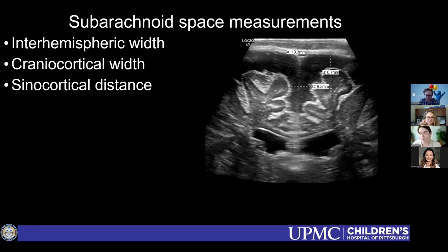Yeah, that's definitely true. And I have a feeling Judy's... Yeah, and we've been having that discussion with our NICU about the ventricular index measurements for the preterm infants, because the Levine index, what they call it, that data is from like 1981, and then there's newer, more updated data sets that go down to younger ages, just because like we talked about, there's more preterm infants that are surviving. But if you compare those 2 data sets, the more recent data has generally larger measurements for the ventricles for the different percentiles.